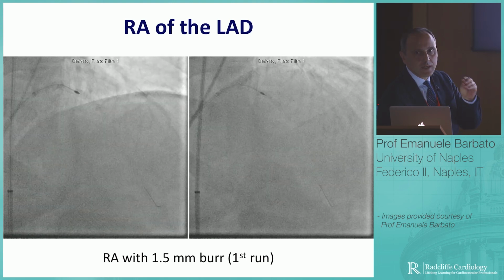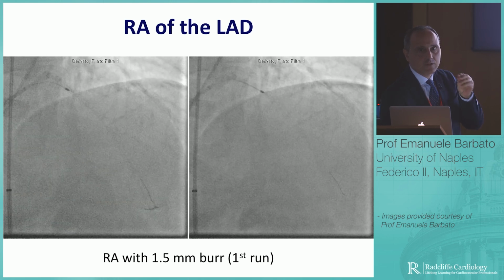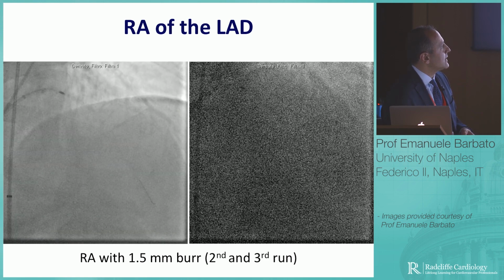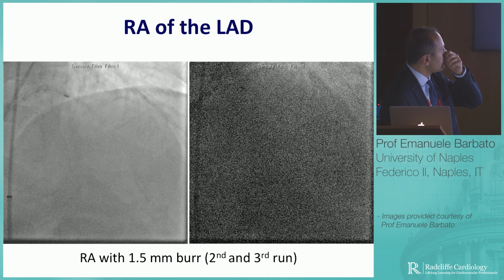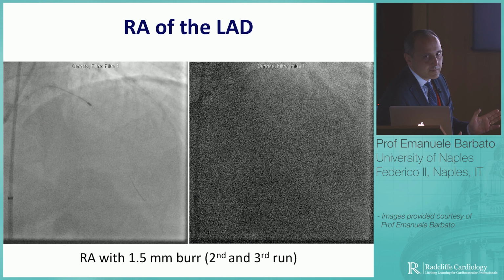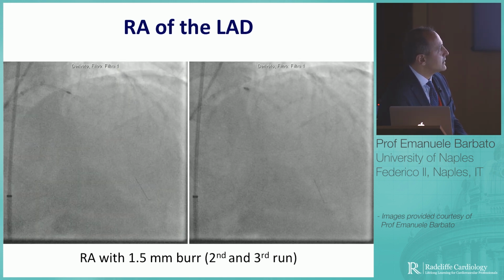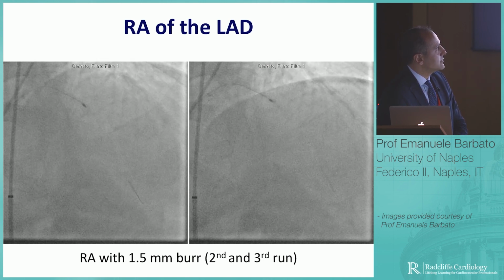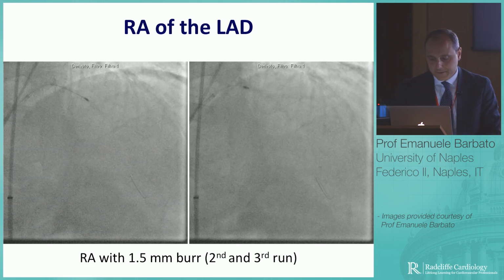Normally, the first run is done really to probe the lesion, to touch it like with a finger to see how tough it is. And then the real attempt is done at the second run. This is the second run here. Always back in motion. You see, never lose your patience, take your time. The third run was still unable to cross. Let's see the third run. Little progress, but the burr doesn't cross yet.